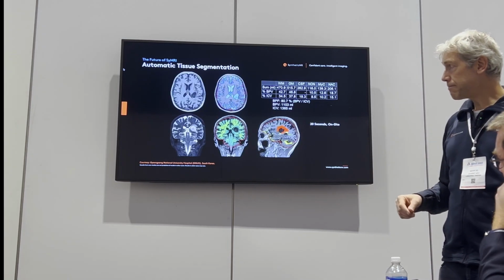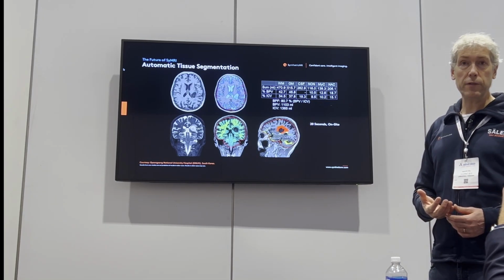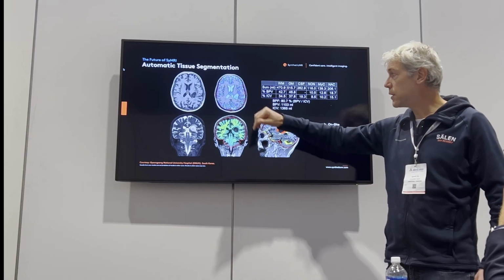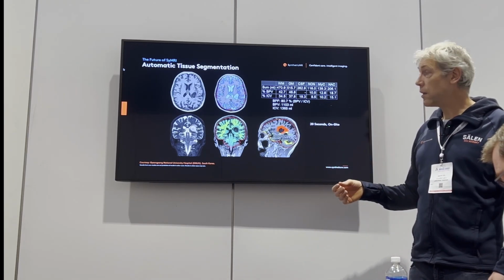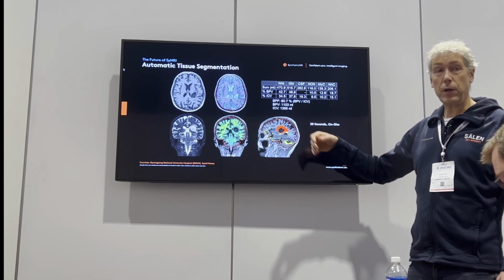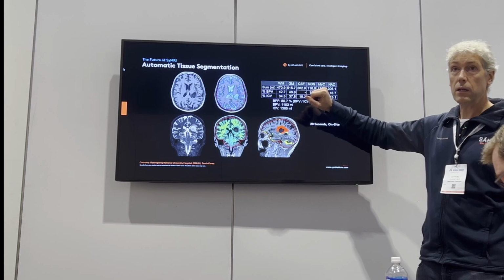And if you have the next slide. But we also provide an automatic solution that can find the brain for you, the intracranial volume and the amount of myelin. And that's all summed up. And so you'll get a table. So here's a few examples where here's, for example, CSF, here's myelin. This is anything that we did not recognize, what we call none. But there's tooling in there that you can selectively select part of that none to see what kind of characteristics that has. This can all be plotted, and it is all summed up in a table.